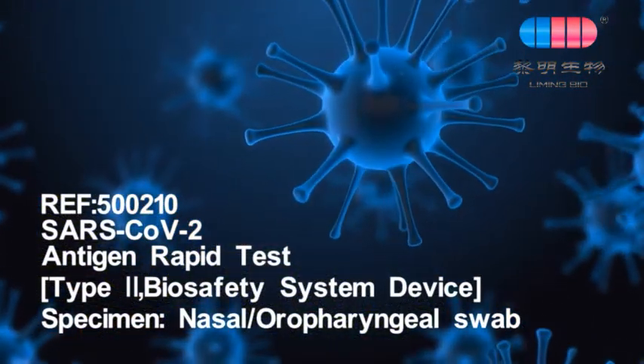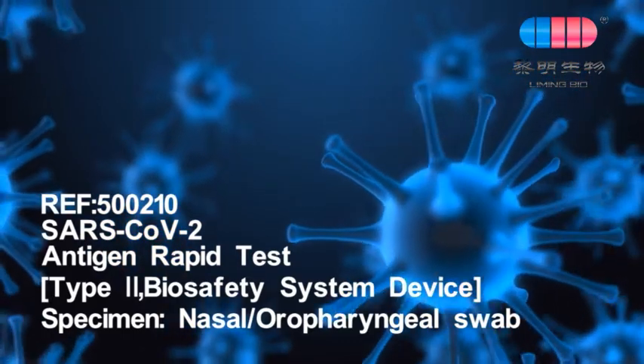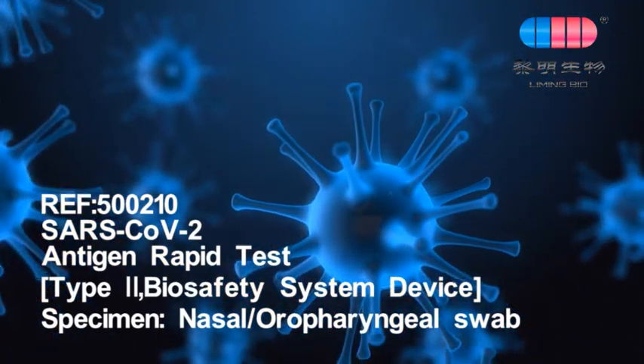SARS-CoV-2 antigen rapid test, type 2 biosafety system device. Specimen: nasal or oropharyngeal swab.